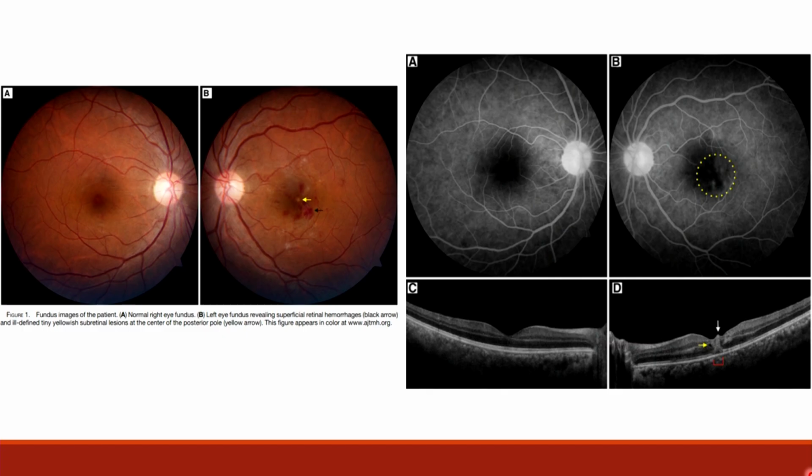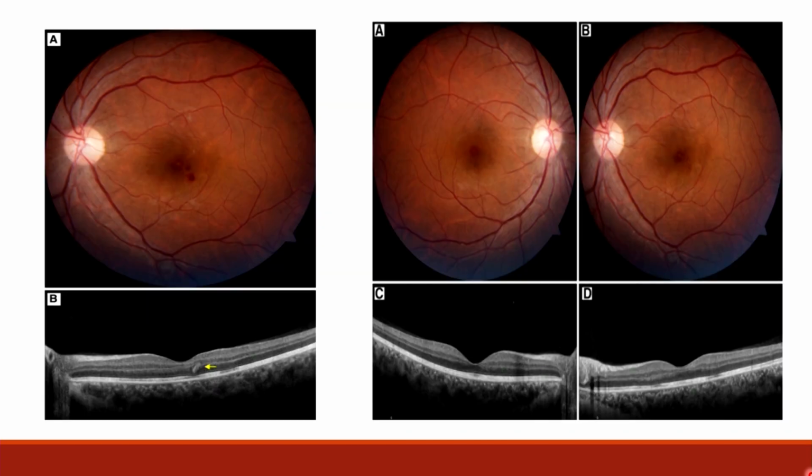And the OCT shows the bracket which is put shows the intact RPE, while vertical hyperreflective lesions shown by the yellow arrow is seen. And again, in this case also, they extended up to above the ILM, internal limiting membrane. So this was on follow-up when the lesions were progressively becoming better, and in the final OCT we can see there are no residual abnormalities, no residual pigmentary changes, and the lesion had completely resolved, and the vision was also restored.